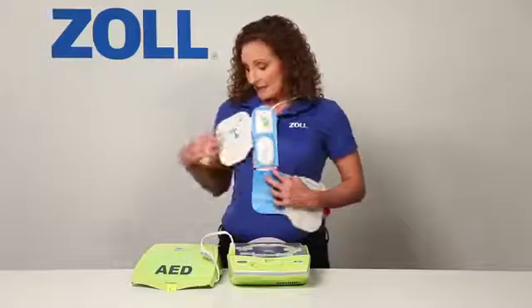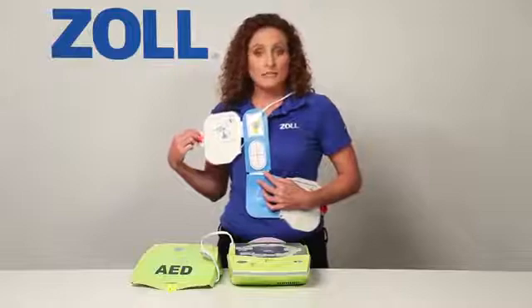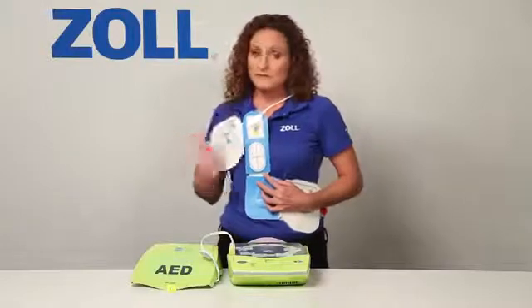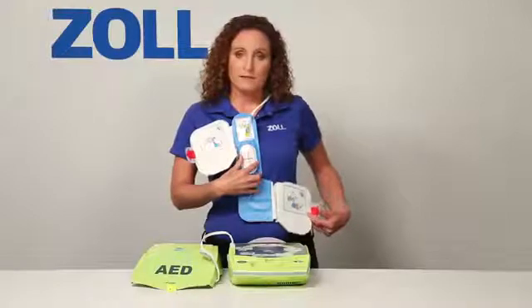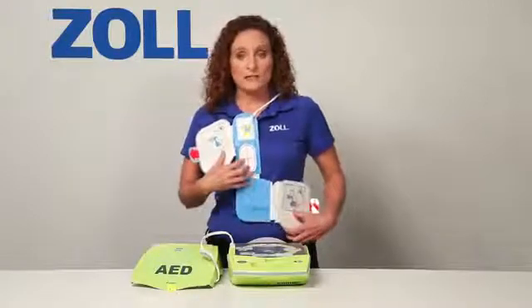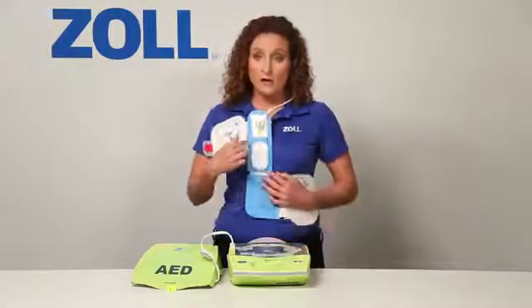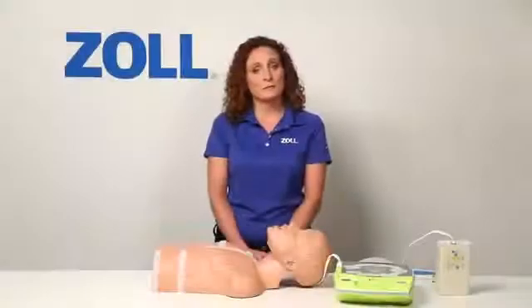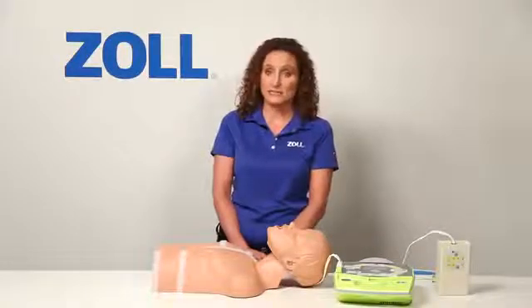Pull on this tab to uncover the gel on the pad and allow it to make solid contact with the victim's skin. Pull on this tab to attach the other electrode pad. Once the pads are attached, CPR can now be done by putting your hands on the red crosshair and doing chest compressions.